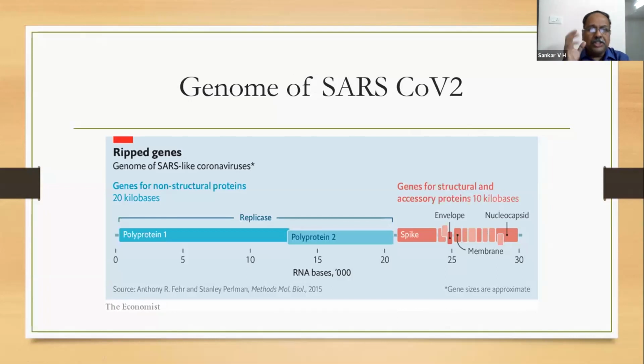So we should know the genome of the SARS coronavirus, and only then can we design the specific primers. There are so many genes in SARS coronavirus, like the spike gene, S gene, N gene, or E gene. That is the nucleocapsid gene, envelope gene, S gene, as well as some important genes for polyprotein, etc. There are many protocols where the primers are designed specifically for the spike gene, or the E gene or N gene. But in a standard RT-PCR, a minimum of 2 or 3 genes will be identified to make sure that we are not going in a wrong direction.